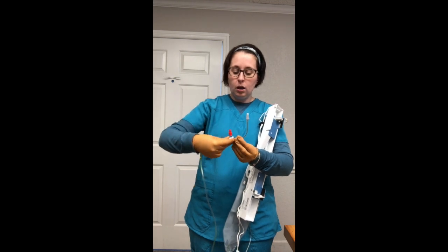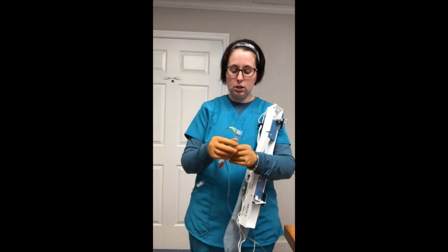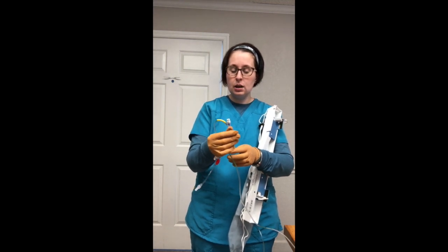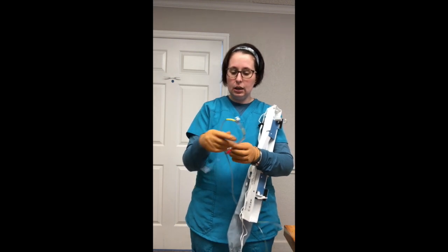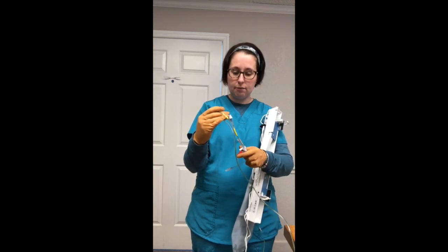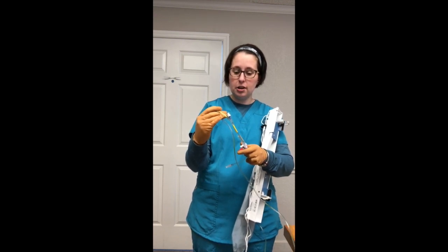If you are obtaining a patient sample, you would use this port above. You would grab a sterile towel, betadine, a sterile syringe, and again don sterile gloves and a mask. You would lay this on your sterile site, clean with betadine, clamp above, and slowly aspirate off 2 cc's of CSF from your patient. This would be placed in a sterile CSF tube and walked down to the lab. CSF should never be tubed.